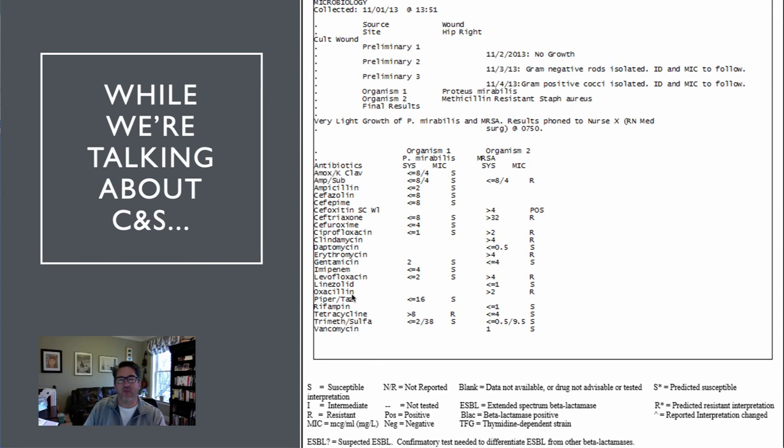All right. And if we look over here, we can see the R and this number. We can ignore the number because that doesn't really tell us the relative benefit of any of these antibiotics when compared with one another. We only know how that response is comparing as a self-control.